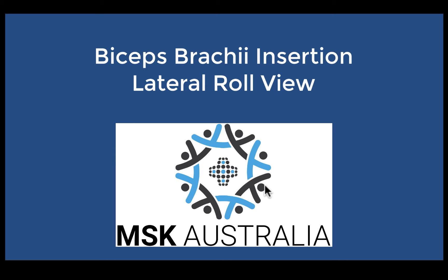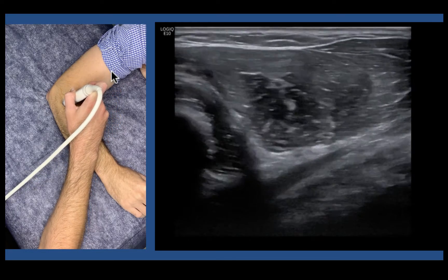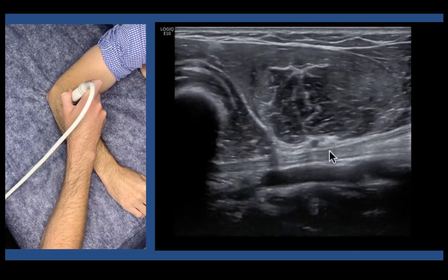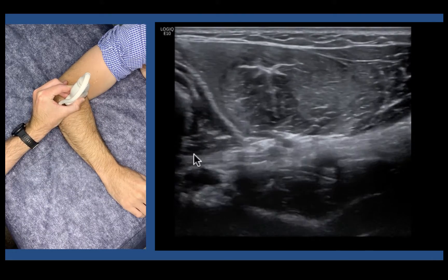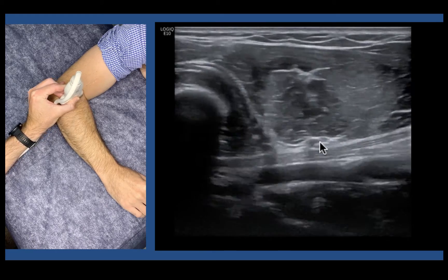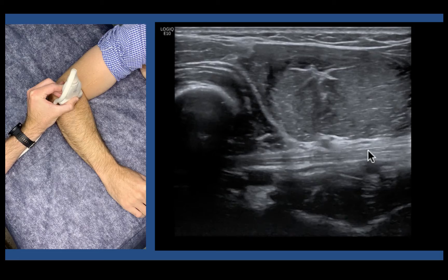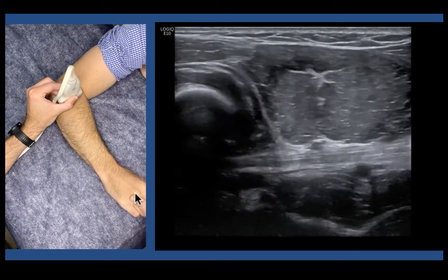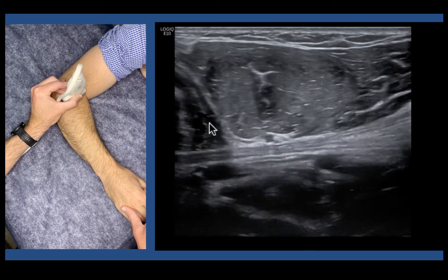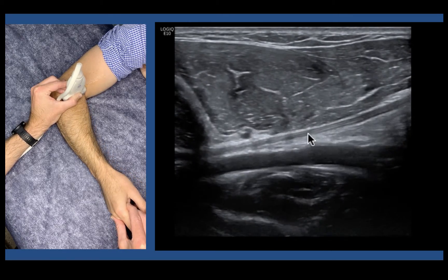Now we're going to have a look at using our lateral window, where we get this kind of roll technique as it's sometimes described. We have the patient's arm bent at about 90 degrees, come down through their muscle, line up, find their radius, and have a look underneath to find the long tendon of the biceps coming in through here. This doesn't give us a good view of the insertion — we cannot see the enthesis — but we get a lovely view of the musculotendinous junction. This is very nice for musculotendinous junction tears and lovely for post-surgical repair to see if it's still congruent. We can assess this by supinating and pronating the forearm — it puts it on tone and reels it around. Your biceps should roll up and around as you supinate and pronate.